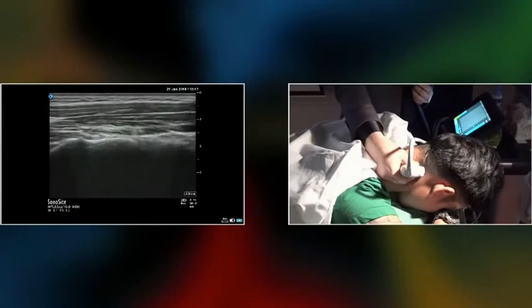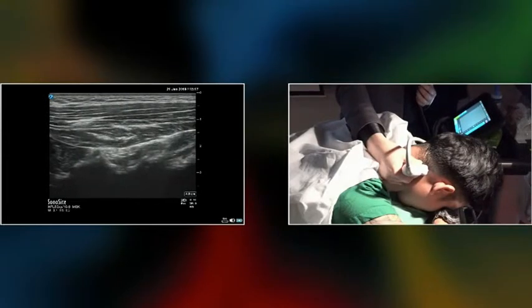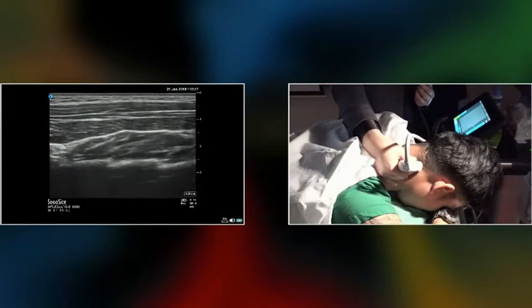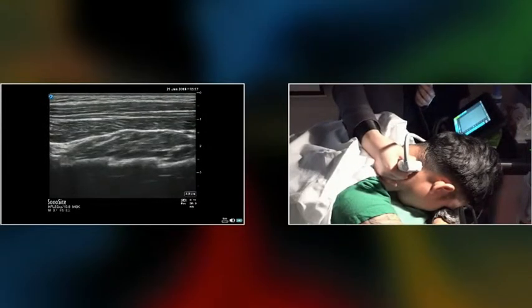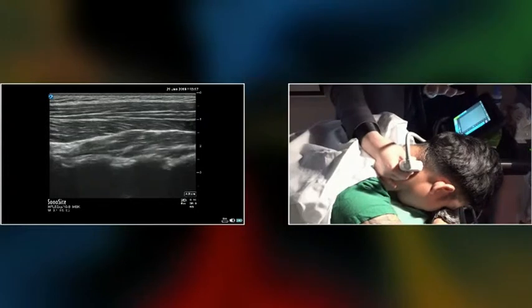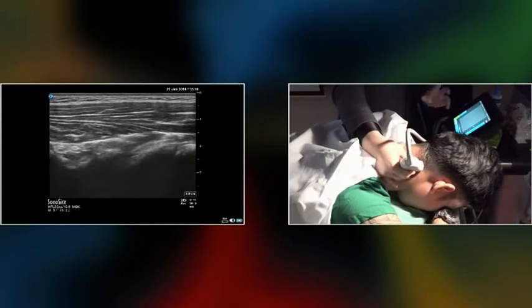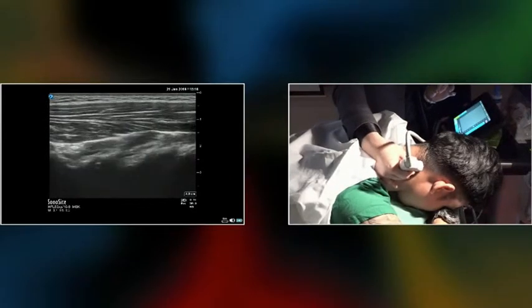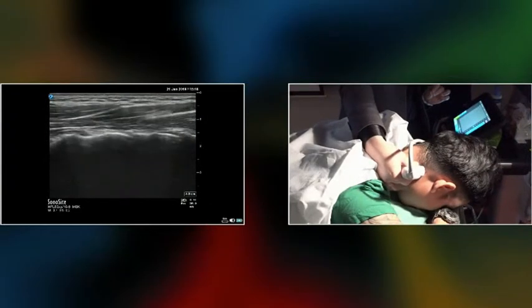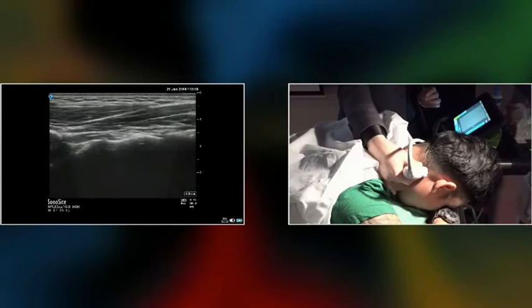And then on the other hand, we can also see longitudinally. That's the long axis. So you can see the C2 and then the C3. And then we can also see how the deep layers of the muscles are locking onto different facet joints. And usually, he has a very nice muscle bulk. But for a lot of patients, I scan on myself, then you can see the deep layers of the muscles, semispinalis muscles, usually will lock up the facet. And that's the reason people have cervicogenic headache and this kind of occipital neuralgia.